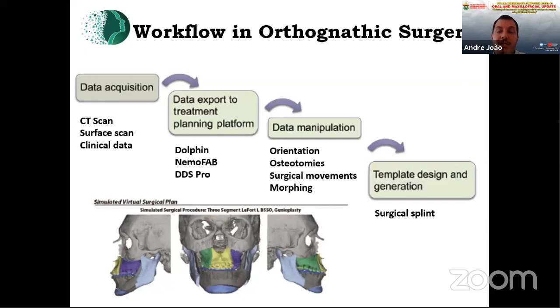Patients with facial deformity usually take different positions of their heads, and the CT scan is taken with the patient laid over a table, so it comes in a position that's not the one the patient assumes in real life. So this is a really important step.